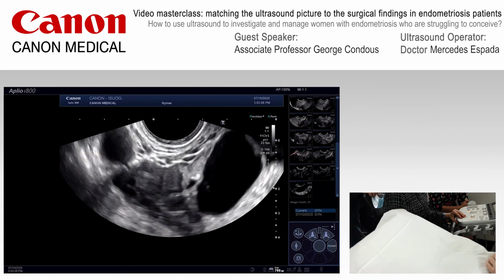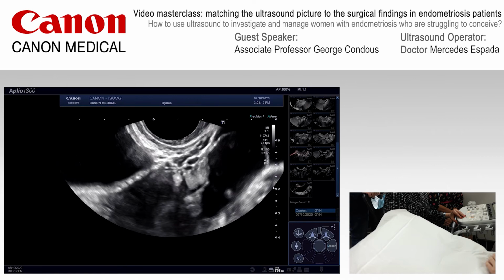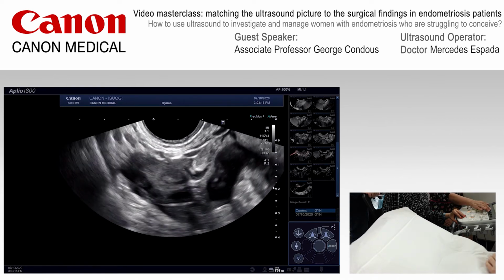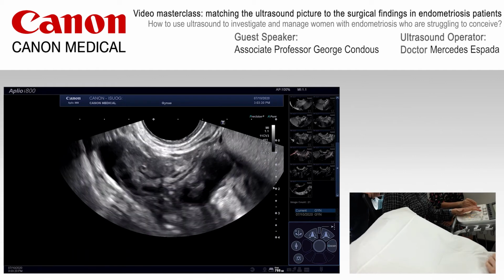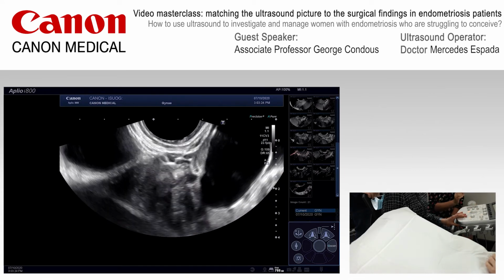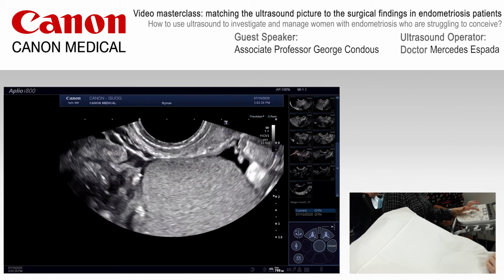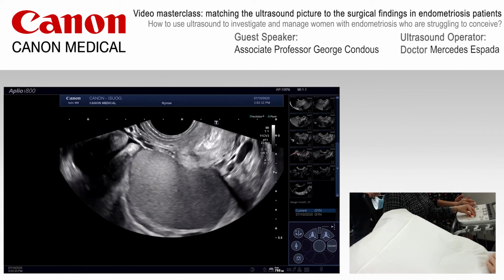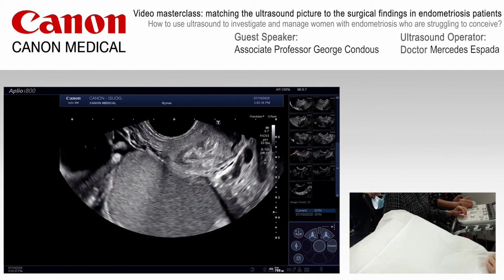So that right ovary looks relatively normal to me, but we can see next to the ovary a unilocular cystic lesion that potentially has incomplete septi, and this may well represent a swollen tube or a hydrosalpinx that could well be related to endometriosis at the distal end of the fallopian tube. In someone that's not had intercourse before, we know that this is not going to be related to any sort of STI or otherwise. So we've got potentially a right-sided hydrosalpinx.